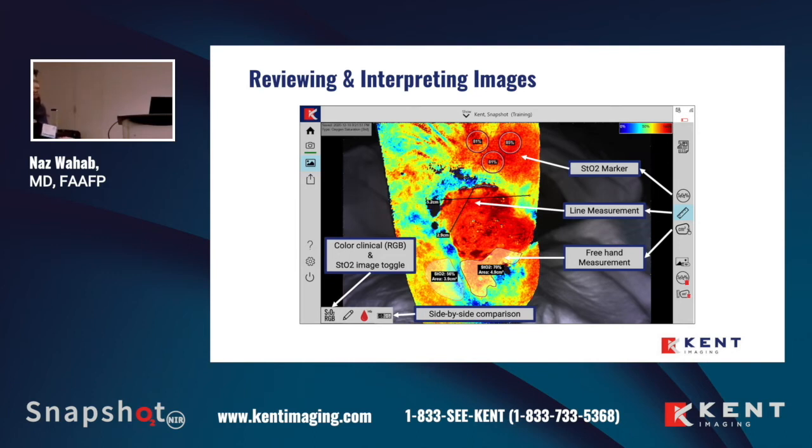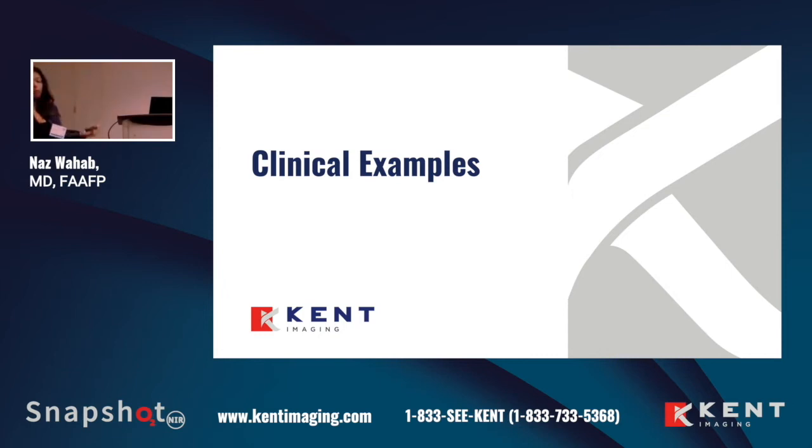Here you can also click on these and you can see side-by-side comparison. You can see the image that I showed you before that has the oxygenated blood, the deoxygenated blood. You can also toggle between those, and we can show you the demonstration a little bit later. So I think the more important aspect is, how do you use this in real life?